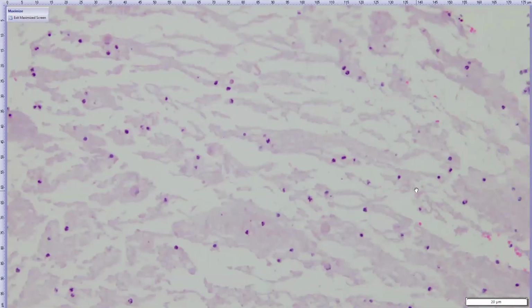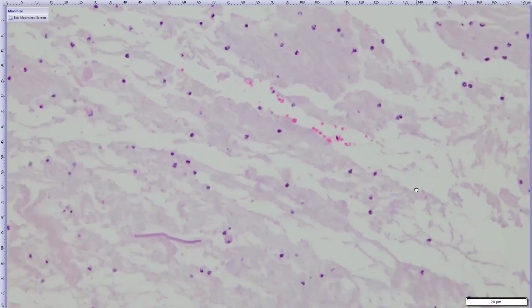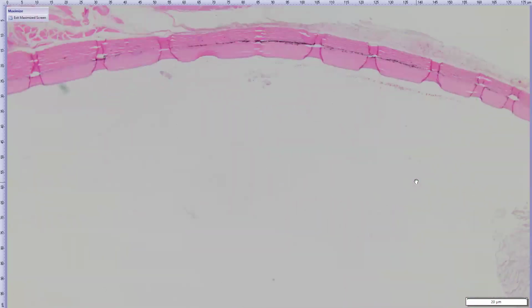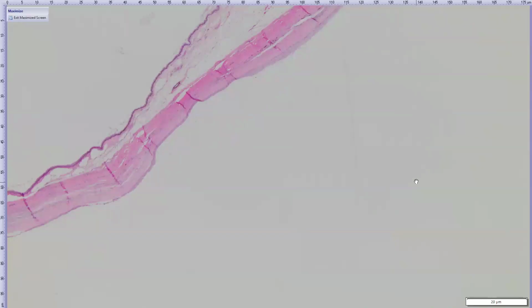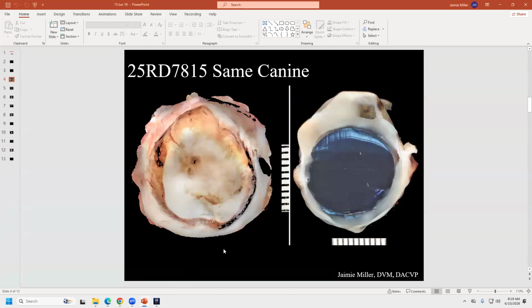Some of those could be keratinocytes too. So it's maybe not perfect for keratin, what we usually see with our keratin samples. So it could be keratin and stuff sloughing off of those epithelial cells. Fibrosis, I think, is usually pretty typical for a scleral shell. And then we have that intraocular extension of the epithelium, which at some point may have caused a problem. So it's probably good that they got it all out.